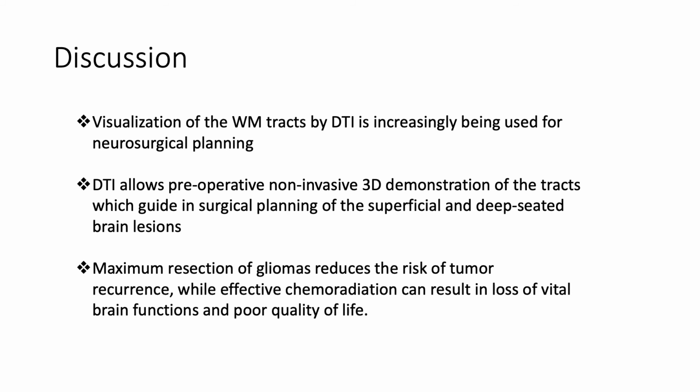The precise location of the white matter tracts in relation to the lesion helps the neurosurgeon in preoperative planning by defining the surgical access point and identifying the extent of tumor resection while preserving vital motor, visual, and language brain functions. DTI provides in vivo tissue microstructure information by measuring water diffusivity for a given voxel in terms of FA and MD.